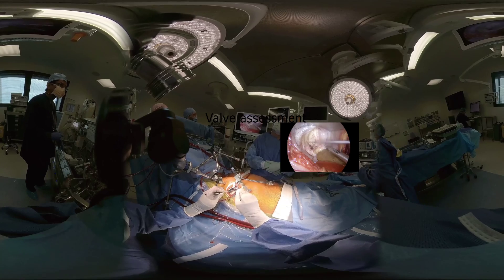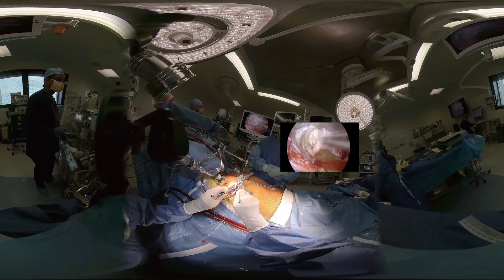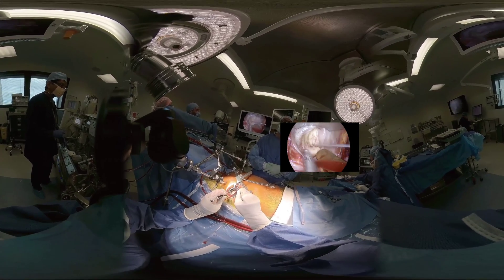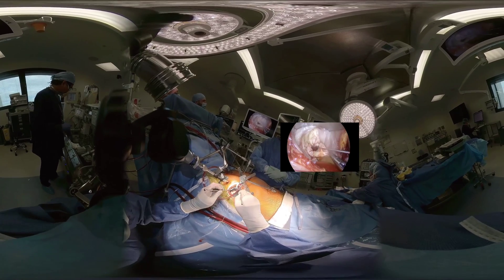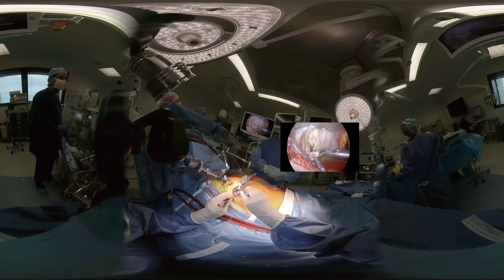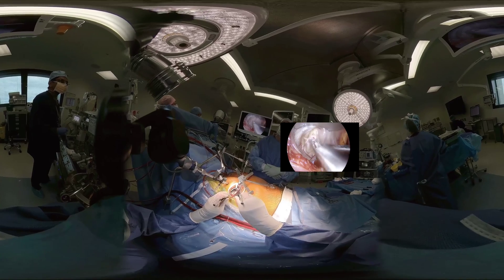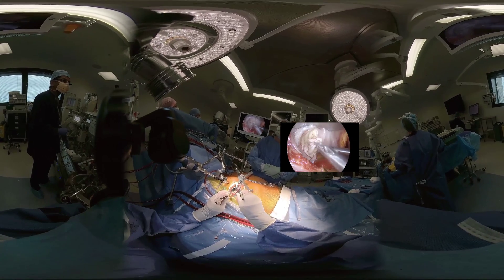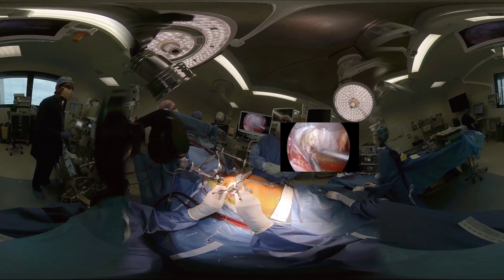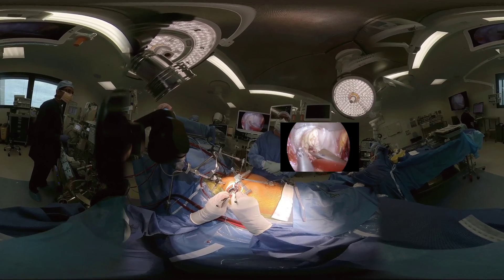In this video, we demonstrate two cases. In the first case, we can see a redundant posterior leaflet with prolapse of P1 and P2, and a competent P3 and anterior leaflets. Dr. Edwards decided to repair this valve by trimming the prolapsing P1 cordae and resecting a wedge of P2. The gap is then repaired with a continuous Prolene suture.